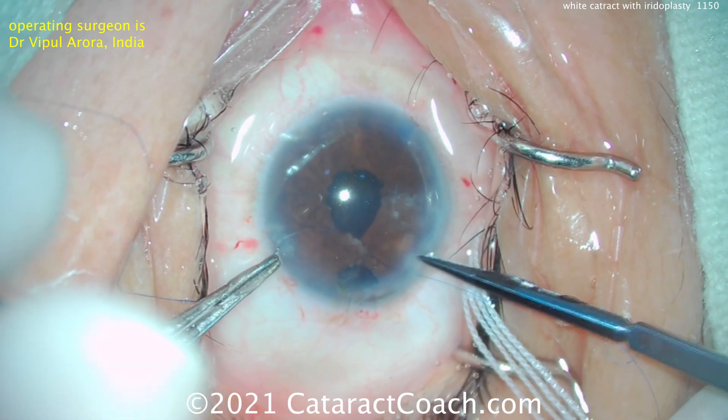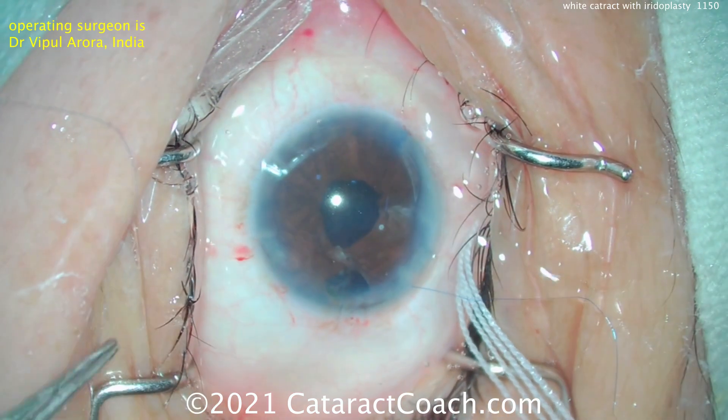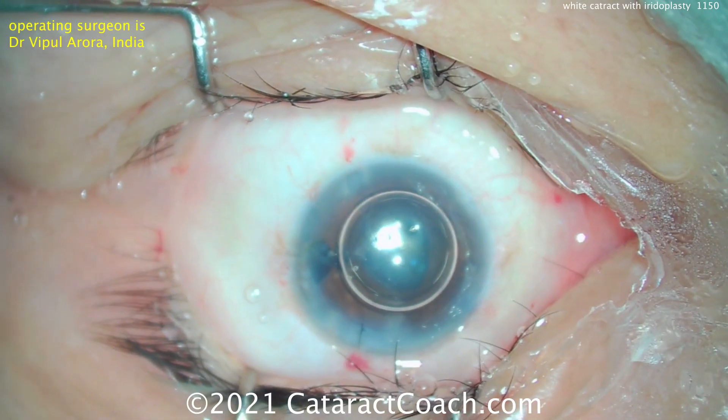And you can see — look at that — that's a much nicer result. It looks like one suture is probably pretty good. Now the ends are cut. You could do another suture to help close up that hole, but in this case an air bubble is placed instead.